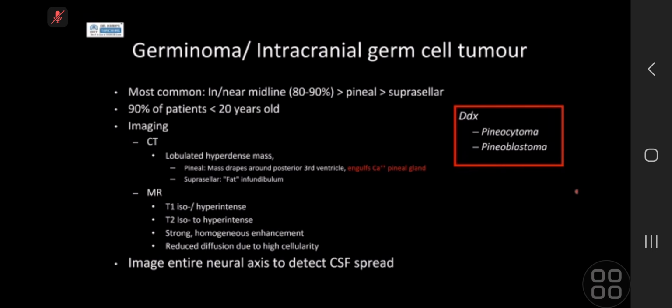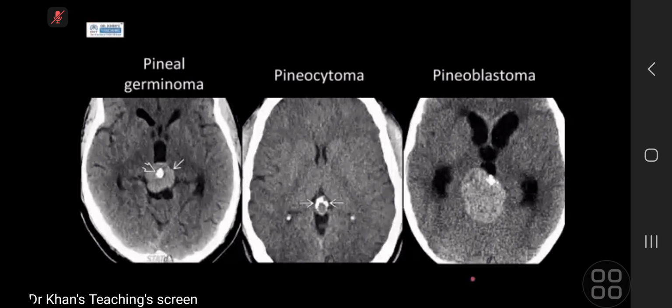And I thought from there, it's good to just revise. This is something that can help you to differentiate between the pineocytoma, pineoblastoma, or germinoma. They often talk about, I can't remember if you remember for your 2As, how the calcification looks if you've got a lesion there. So in a germinoma, often the calcification is central.